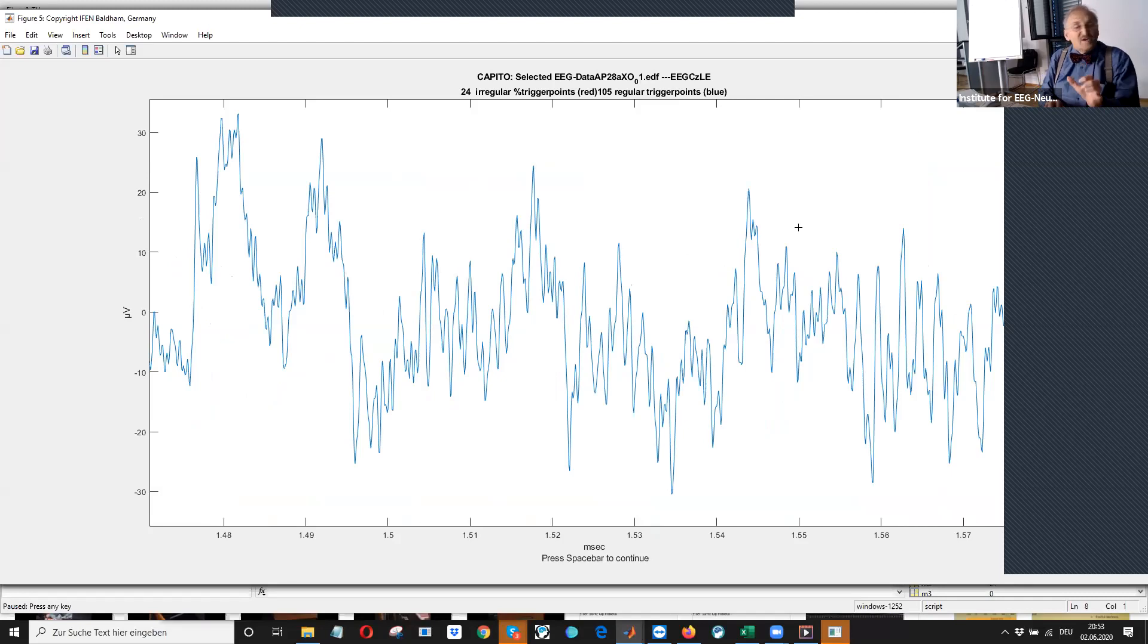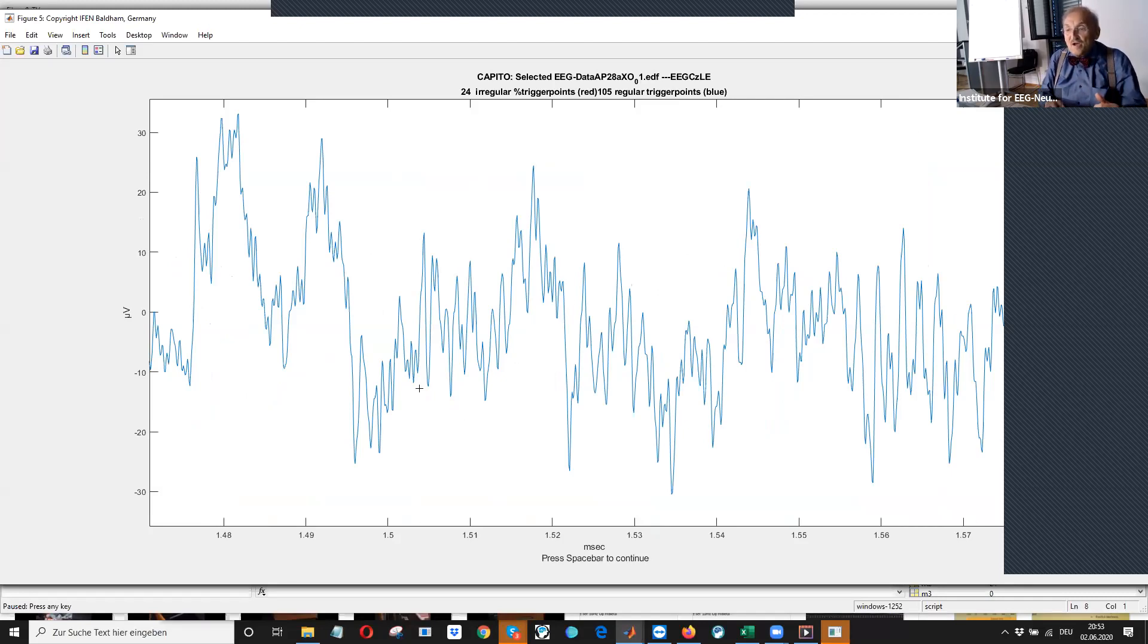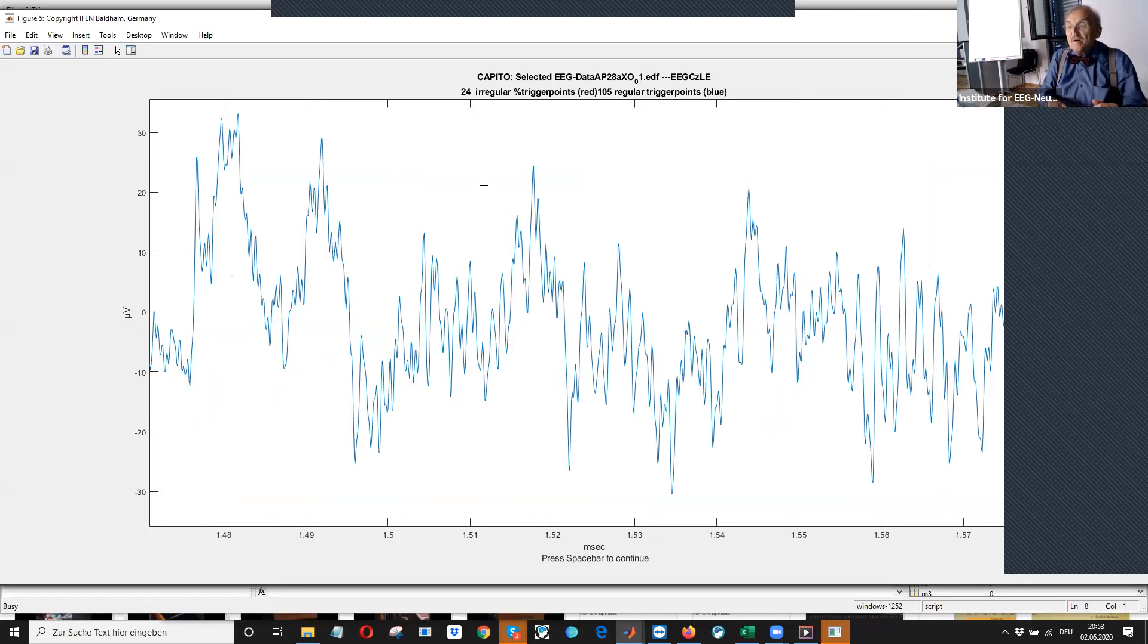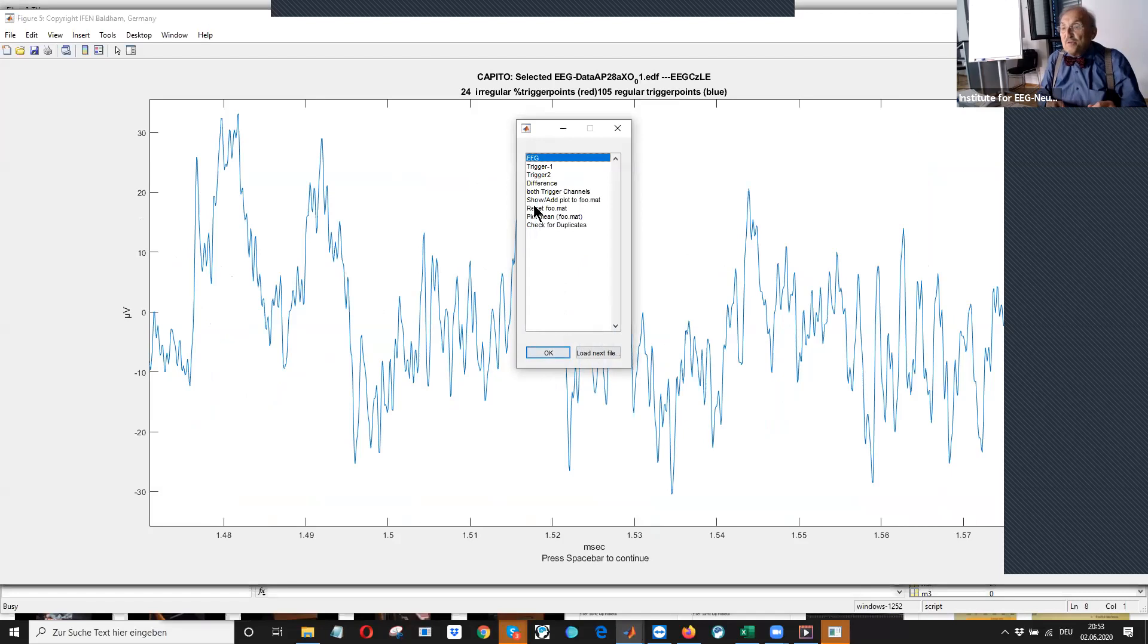But by the averaging, yeah, you can see there is a clear going up and down at this P300. What we will now do is we will store this.